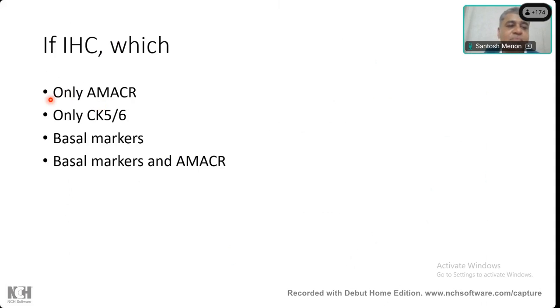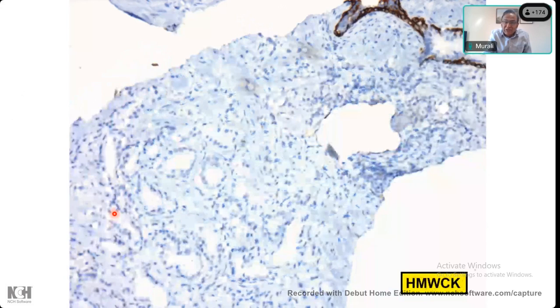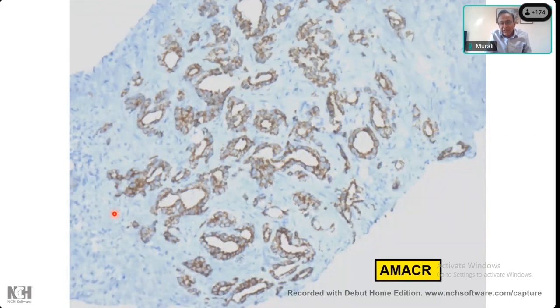Verma sir is a very, very strong proponent of not using AMACR. I don't think you use AMACR. Yes, I'm afraid I hardly ever use AMACR. I think it's important for the trainees, even from year one, to understand that the diagnosis is H&E. Yes. And immuno is to confirm your diagnosis. So your diagnosis is never made on immuno. It's an H&E diagnosis supported by immuno. Yes. And the immuno choice depends on the morphological differential diagnosis.